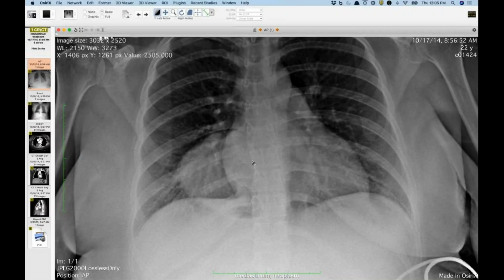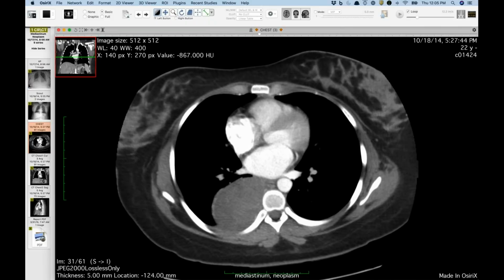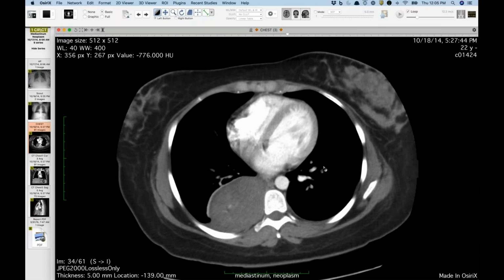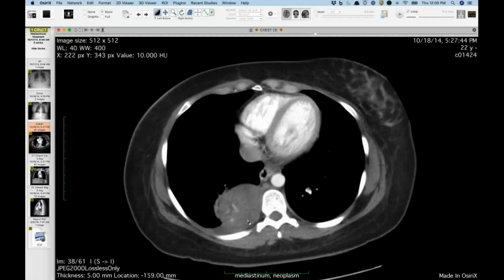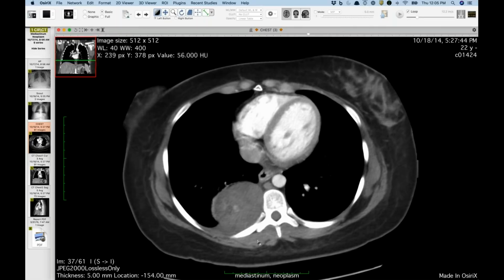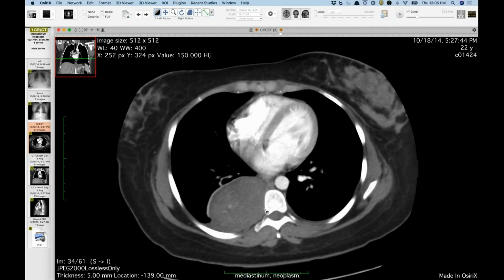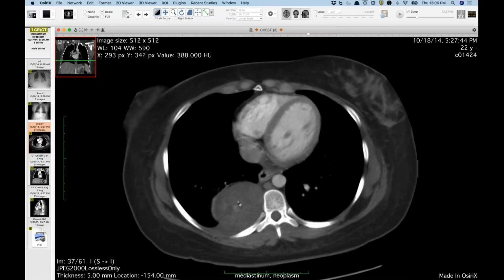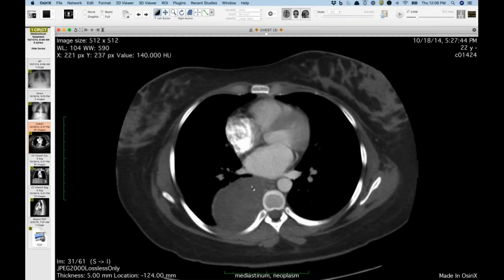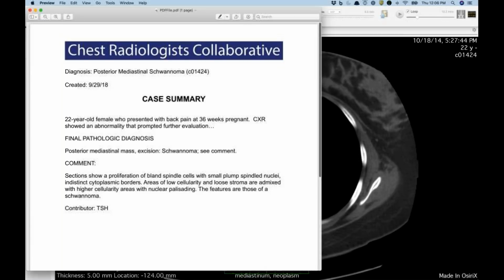What I really like though is this right here. This is an outside radiograph, but it indicates there's probably some level of chronicity, because it kind of bevels out the ribs or the vertebral bodies right there. So it's posterior mediastinal, unilateral, so you're thinking probably nerve sheath tumor. On the CT, it's a well circumscribed mass, heterogeneous attenuation. There's probably a small effusion adjacent to it, but they took this out, and it did turn out to be a schwannoma. I like the little beveling of the vertebral bodies, indicating it's probably been there for quite a while. I guess solitary fibrous tumor of the pleura maybe, but she's pretty young. So a good look for a nerve sheath tumor, which is what this turned out to be.